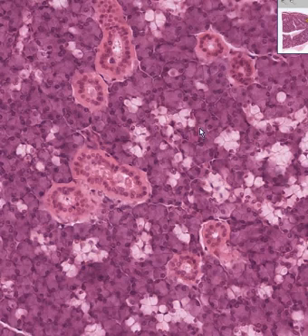of mucus serous is a submandibular gland, because it is. But actually, there's probably generally more serous elements than there are mucus, perhaps 2 to 1. You be the judge because you have a representative field.